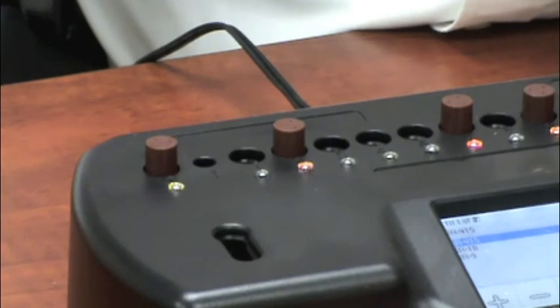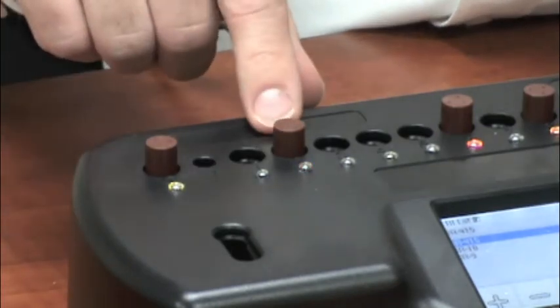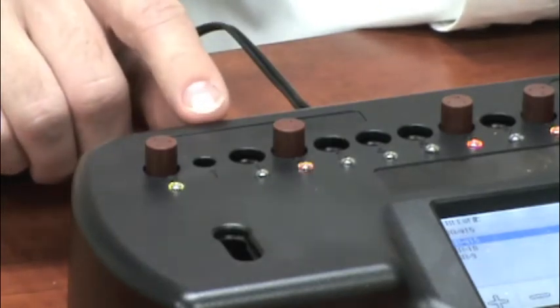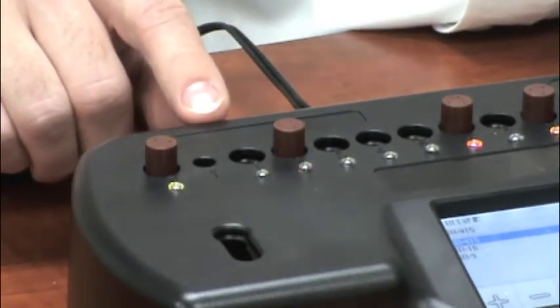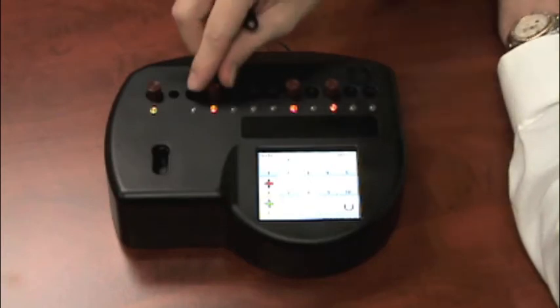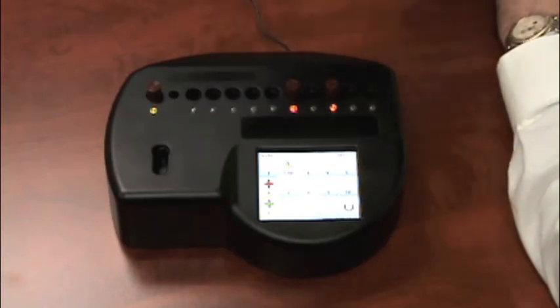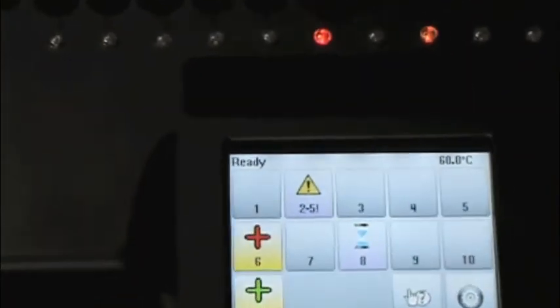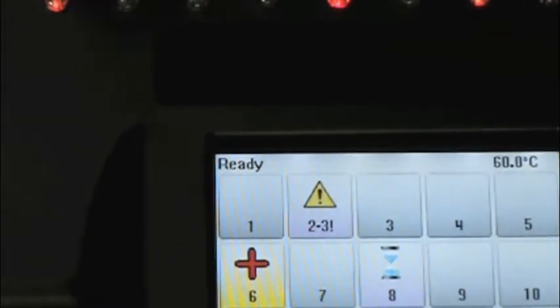When a new biological indicator is inserted into the cell, the LED on the top will blink amber, and this is to signify that the incubator is expecting the user to enter more information in the BI Insert Wizard. If a biological indicator is removed from the incubator before the test is complete, we have a 10-second countdown timer. At the end of the 10 seconds, all data from that cell will be lost. It's important to replace the biological indicator before that 10-second countdown expires.